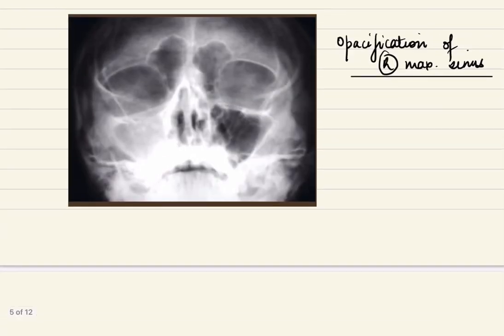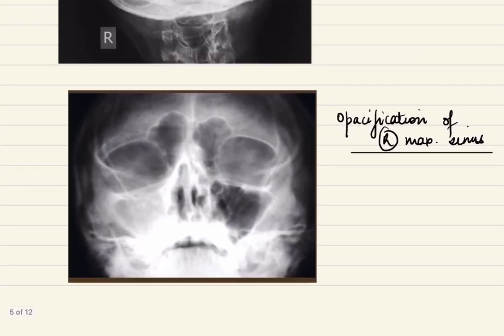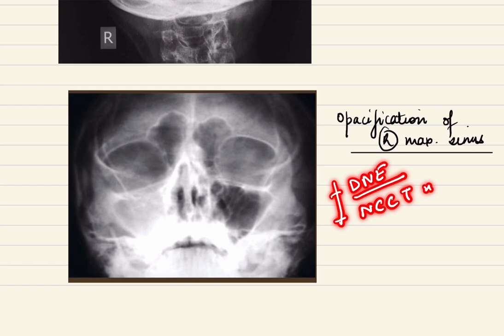Now, if you are presented with such an X-ray, you may be asked how do you proceed with the management of the patient. So, a couple of things you have to do is firstly being the diagnostic nasal endoscopy of the patient and a non-contrast CT scan of nose and paranasal sinuses. A non-contrast scan is enough if you are suspecting sinusitis. Unless you are suspecting a malignancy, a non-contrast scan is sufficient.